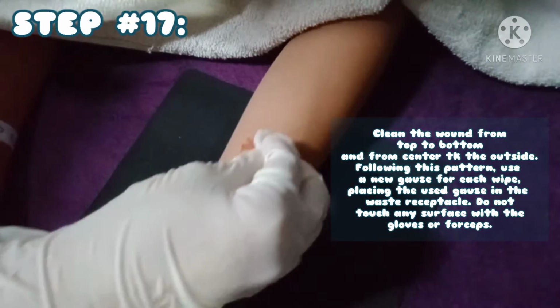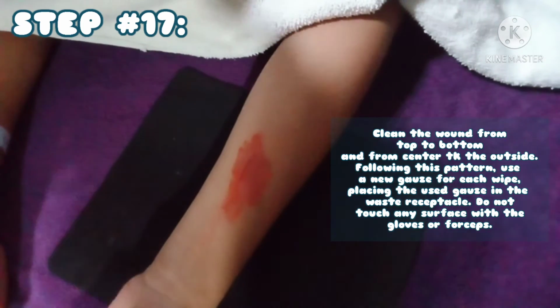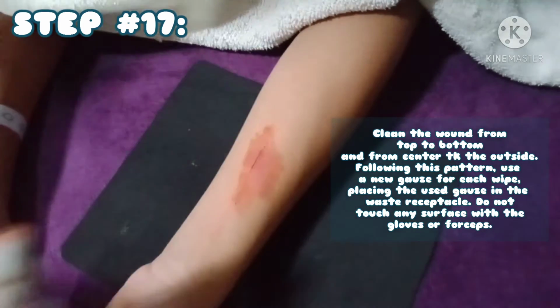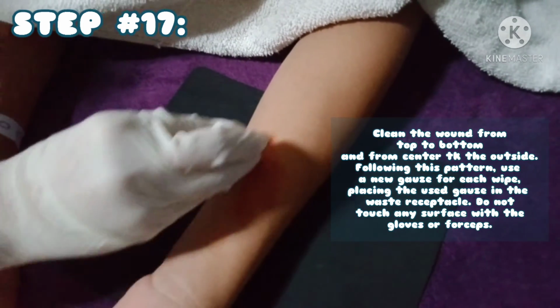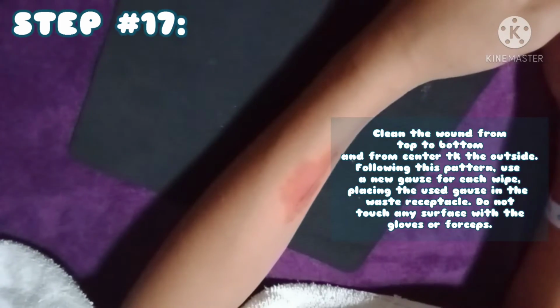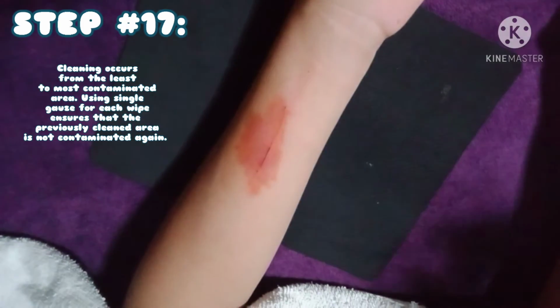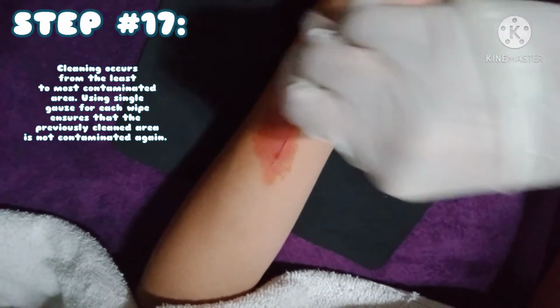Step number 17. Clean the wound. If needed, use sterile forceps to clean the area. Clean the wound from top to bottom and from the center to the outside. Following this pattern, use a new gauze for each wipe, placing the used gauze in the waste receptacle. Do not touch any surface with the gloves or forceps. Cleaning occurs from the least to most contaminated area. Using a single gauze for each wipe ensures that the previously cleaned area is not contaminated again.